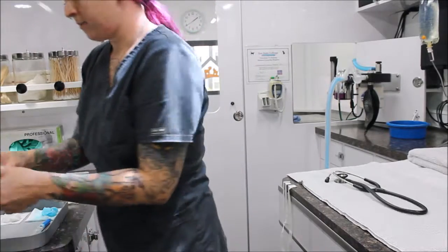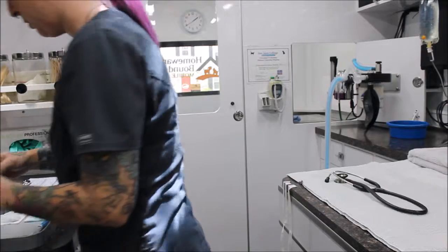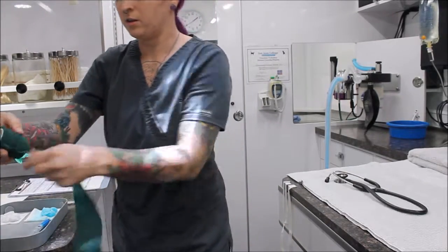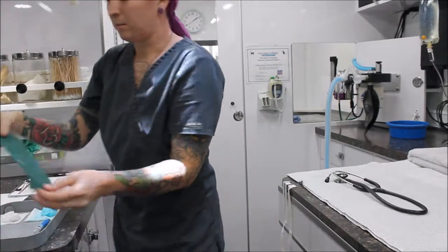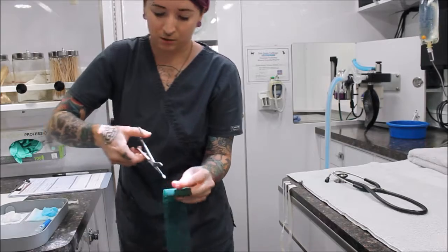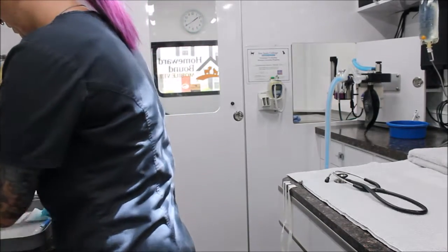So then after I have my tape prepared here, I'm going to get my VETT wrap, and we also use VETT wrap as kind of an extra security method for putting it around the catheter. And I'm just going to cut a little hole in there for the catheter, and we are good with that. I'm going to set it right here.